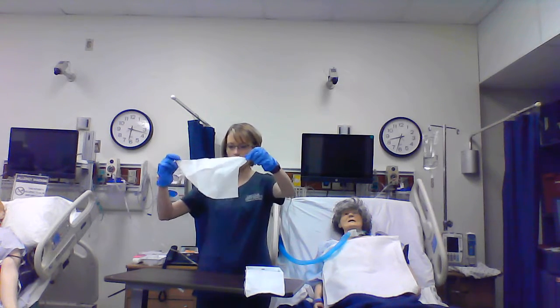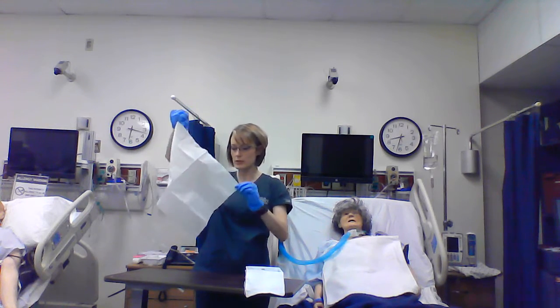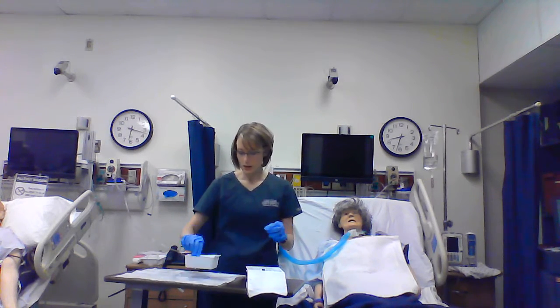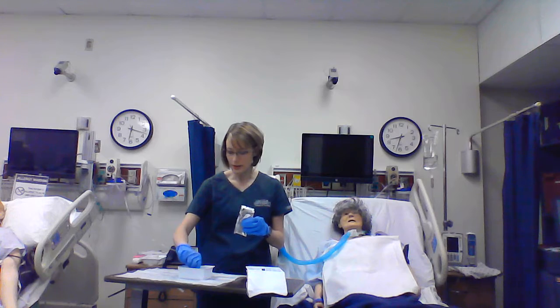So opening my drape, minding that I have a 1-inch border around this drape that's considered unsterile. And these kits come with this inner box and some 4x4 or gauzes, hydrogen peroxide. I have Q-tips in here.